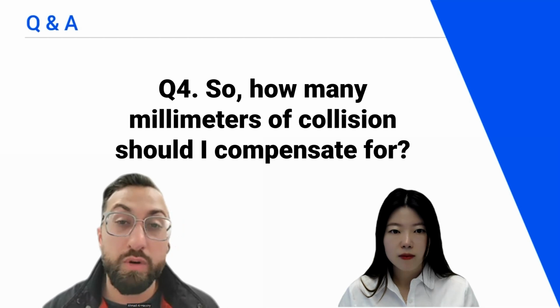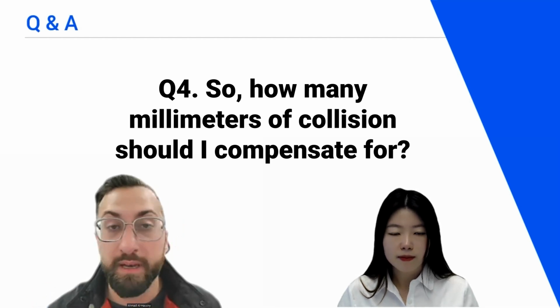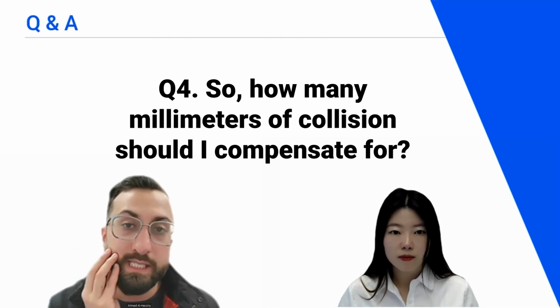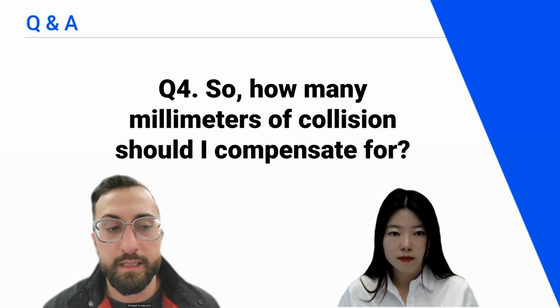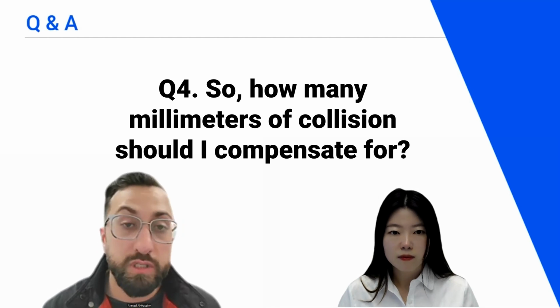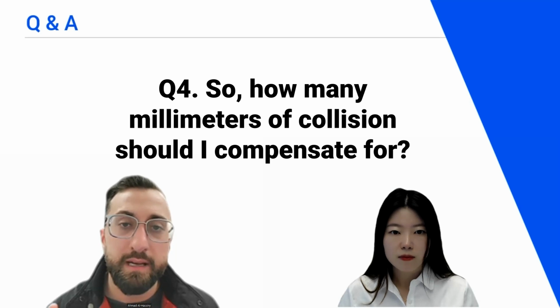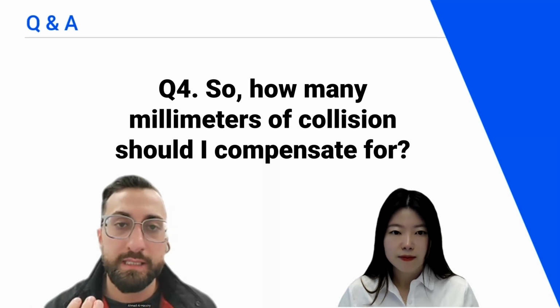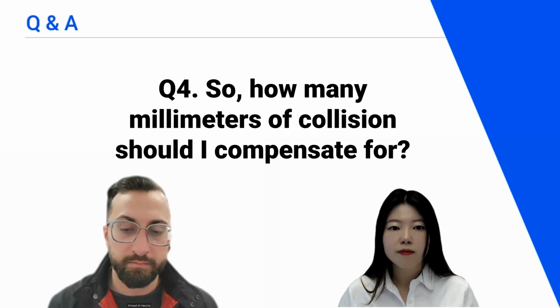And typically what I would do is rescan. If you've taken 2 bite scans and this is happening, just delete the scans and do it again. But if you've only taken 1 scan on one side, do the opposing side. And that's really the solution for most intersection issues that I find, especially recently because Medit released that mandibular and occlusal analysis that happens after you take 2 scans. This happens automatically, and it helps reduce any intersections.